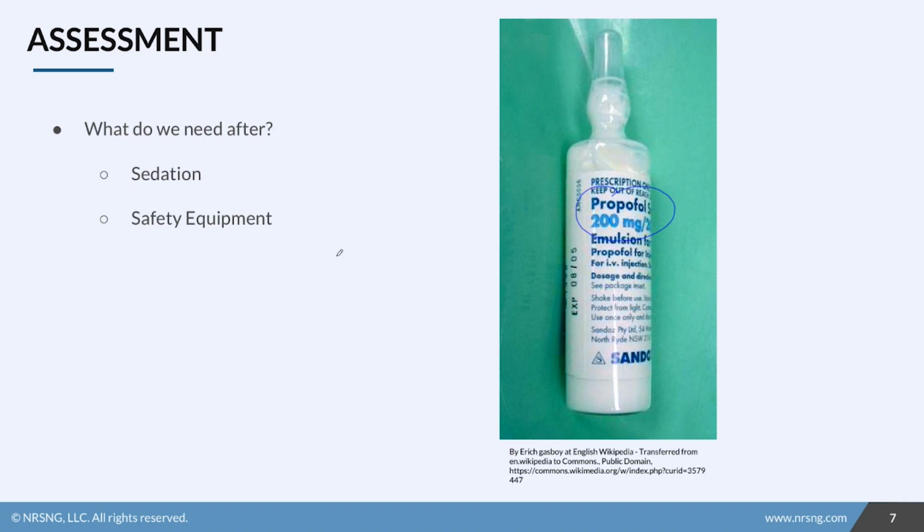We also need some extra equipment here. So you want to get a tube securing device. Now, it's basically to hold the tube in place. So this can be something as simple as tape, which wraps around the patient's head and around the tube and secures that in place. There are also actual ET tube holders, which have a little clamp on them that sits over the mouth and holds the tube in place.